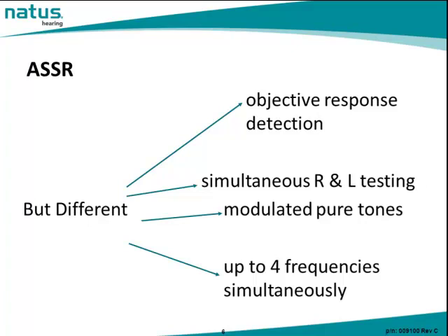With ASSR, we can test both ears at the same time, if we choose, with up to 4 frequencies in each ear. And perhaps one of the most significant differences with ASSR is the stimulus. ASSR utilizes modulated pure tones as opposed to clicks and tone bursts.